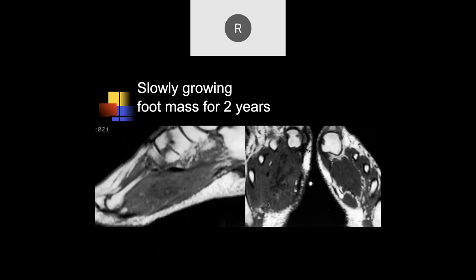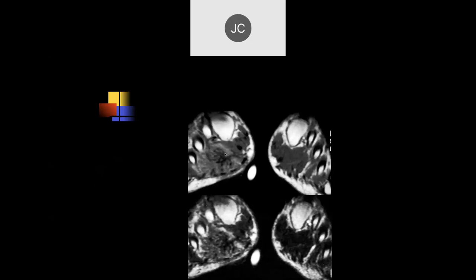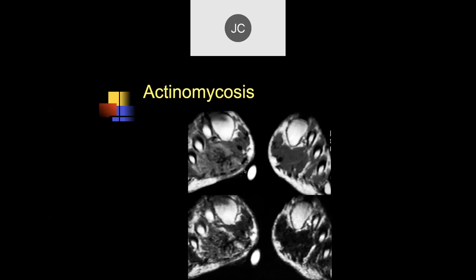A slowly growing foot mass for two years. There's soft tissue thickening and a mass along the plantar aspect of the foot with low signal. The T2 images from the early days before fat suppression show this turned out to be actinomycosis. There was a draining sinus — the marker was right over the draining sinus — with a little sulfur granule visible. There's a lot of edema and funny low-signal structures within it. This is the only case of actinomycosis of the foot I've personally seen.